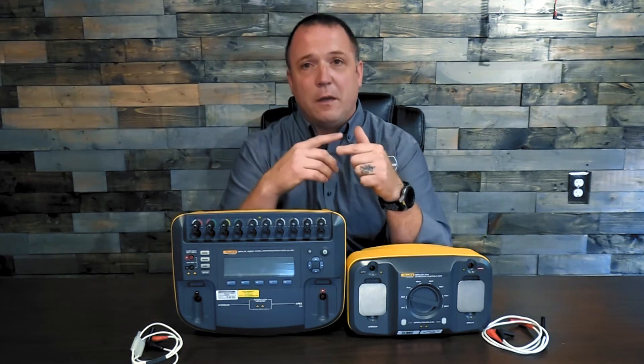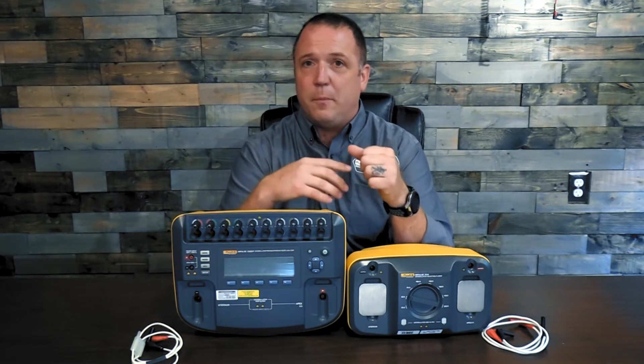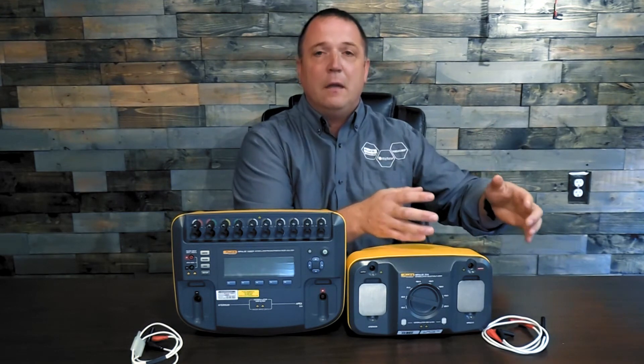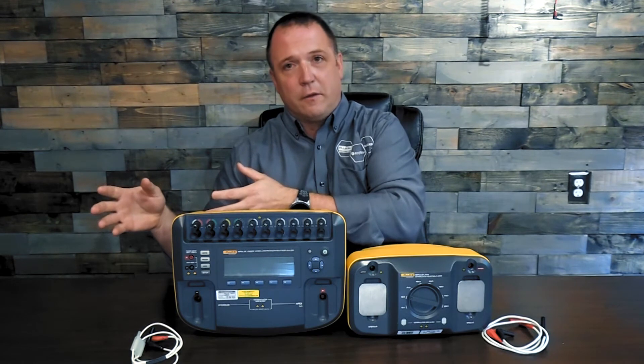We have to assume that the defibrillator is going to discharge at the same joule output every time. So if you set it to 50 for a baby, you should get 50 joules on a baby just as much as you get 50 joules on the other end of the spectrum.